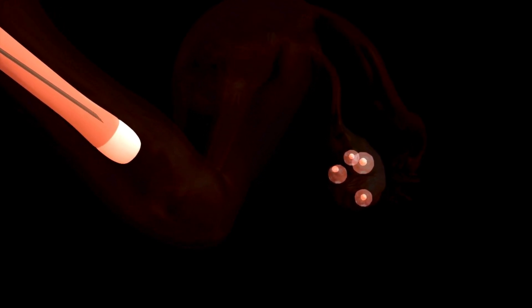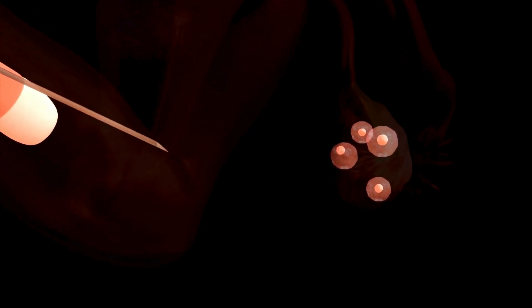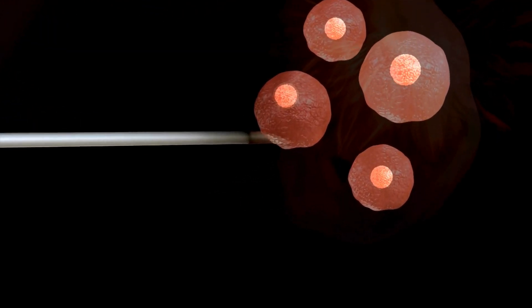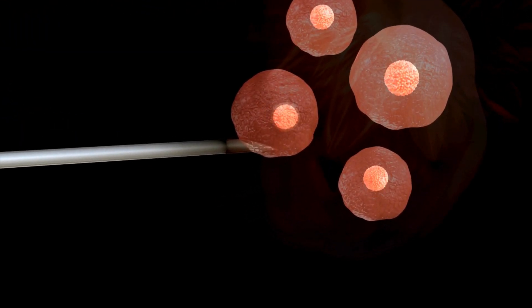The needle is used to aspirate, suction out, the fluid from the follicles, which contains the eggs. This fluid is then passed to the laboratory for identification and isolation of the eggs.